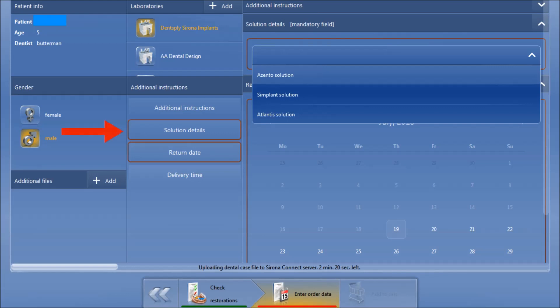The thing that might be a little bit different is we'll click on Solution Details, and under Solution Details, we're going to select Azento as our workflow. Then we simply submit and commission this case.